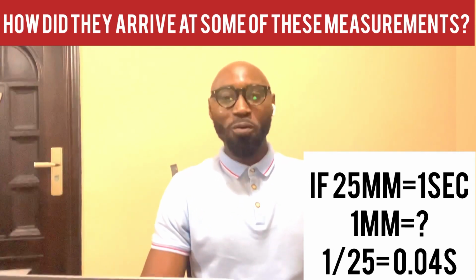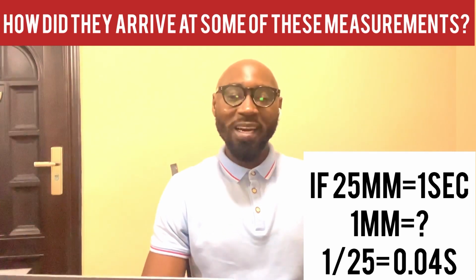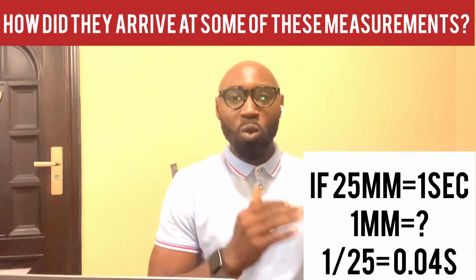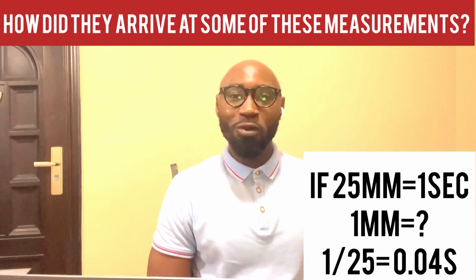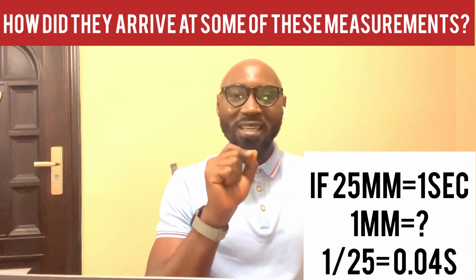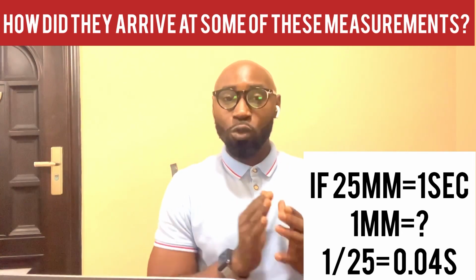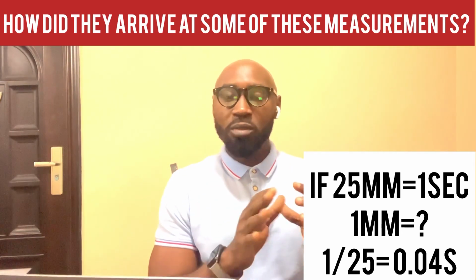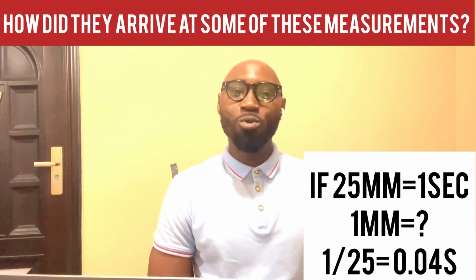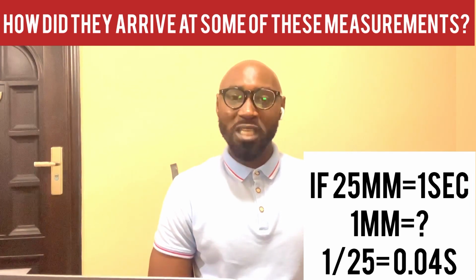By simple proportion, all we do is divide 1 by 25, and we arrive at 0.04 seconds. So it is because of this standard rate of 25 millimeters per second that we have this measurement of one small box on the horizontal axis equating to 0.04 seconds in terms of time.